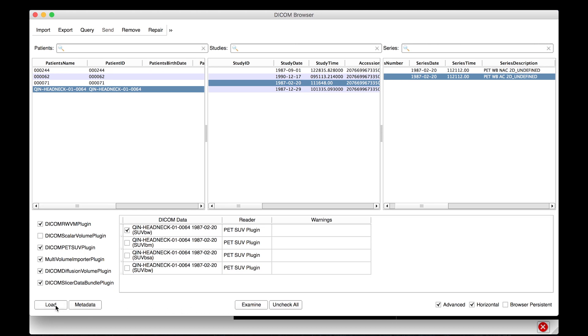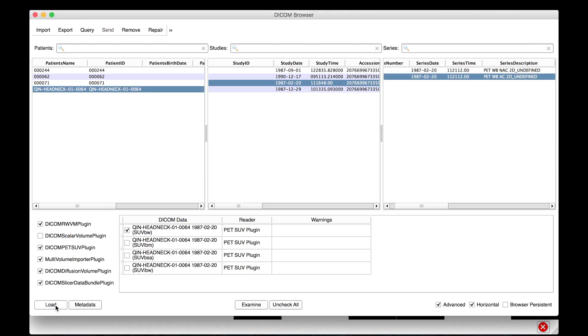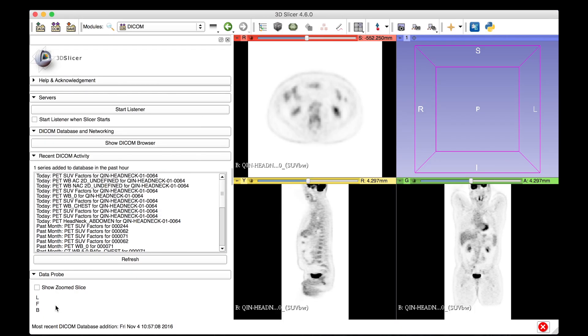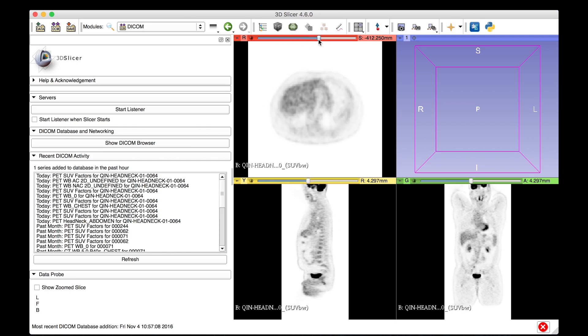After selecting the SUV normalization of your choice, you can load the dataset. The PET-SUV plugin will calculate the SUV normalization factor, normalize the uptake values in the dataset, and store the normalization factor in the DICOM database for future reference.